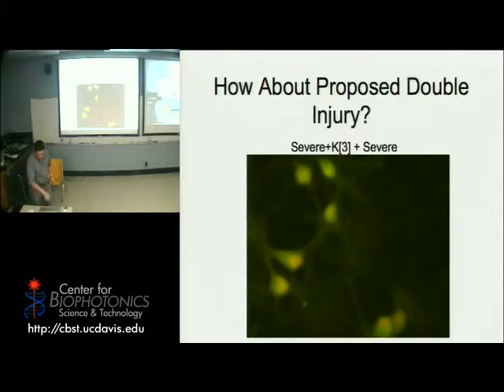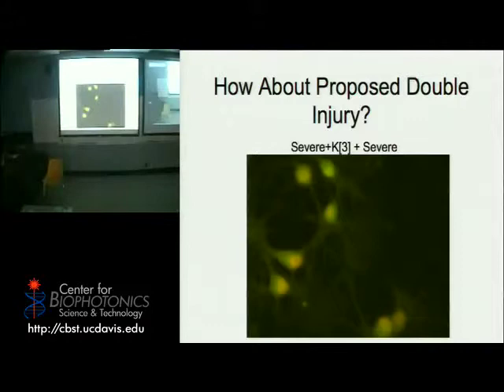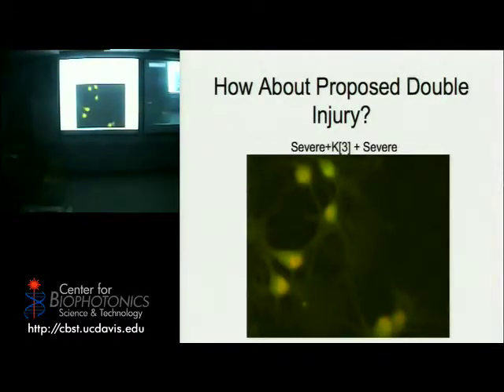And so here's a movie from a severe injury in normal Ringer's, and then 60 minutes later, severe. It's hard; it doesn't show up great. Is there another way to turn it? Okay, so it comes out a little better on the screen. These are less green, a little bit more red. And you'll see there's a couple times where I'm just moving it. But you'll know very quickly when I actually do the injury. I'll see if they just jump to green.